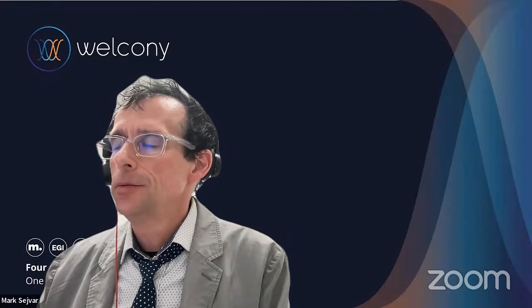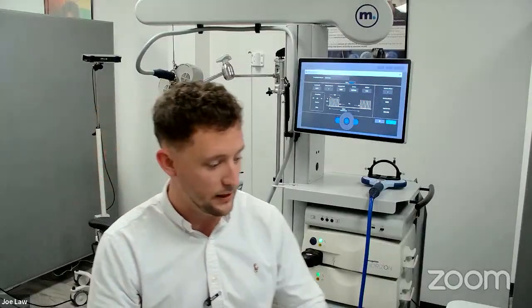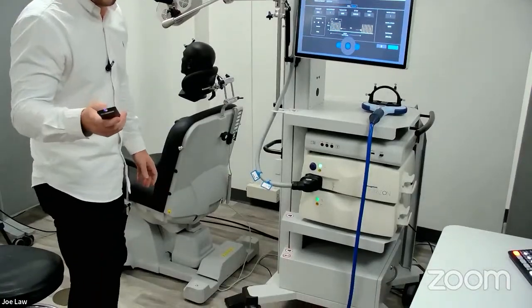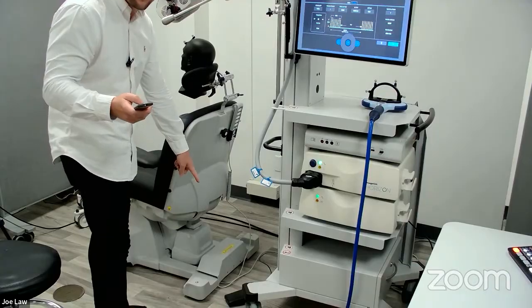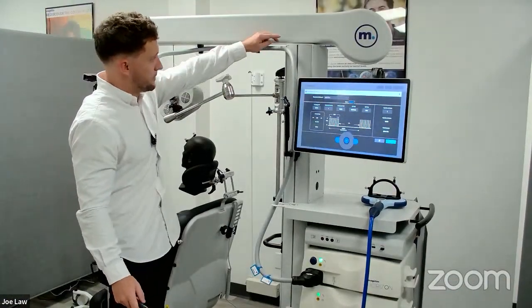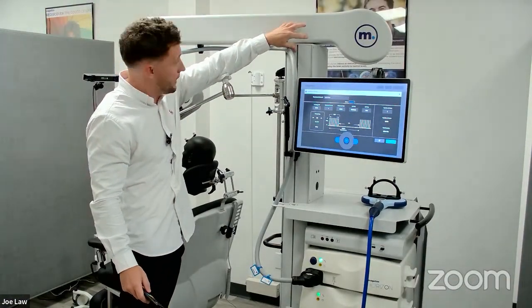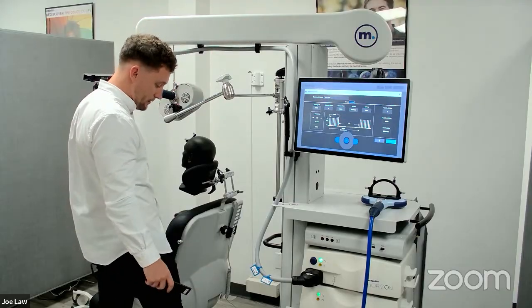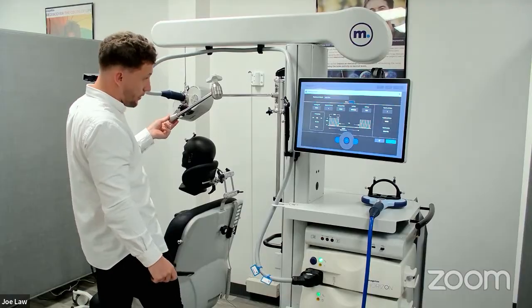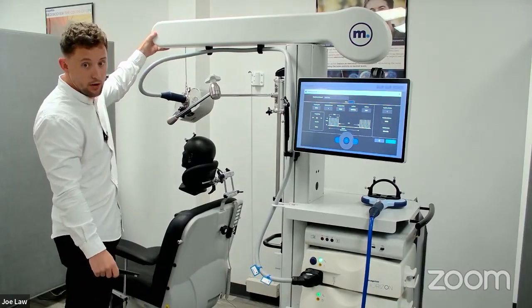Great. How is the mast released in order for you to rotate it? Are you holding something? Yeah, apologies. I don't think the camera's picking that up. But if I try to do this, you can see here that there's a footrest on the floor. When I press that footrest, there is a magnetic brake in this mast here. Once I press it, it unlocks the boom. Once I let it go, it's now locked, so this will no longer move.